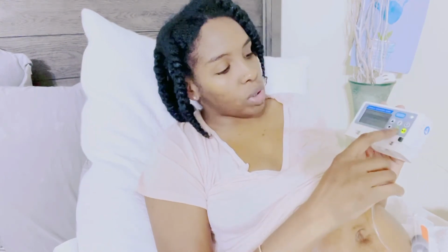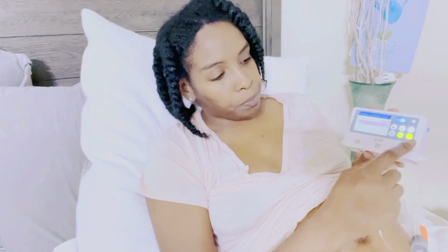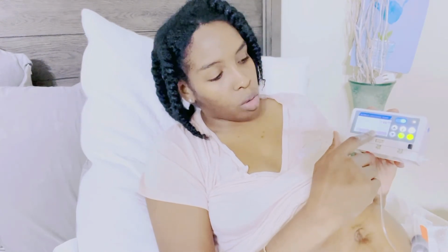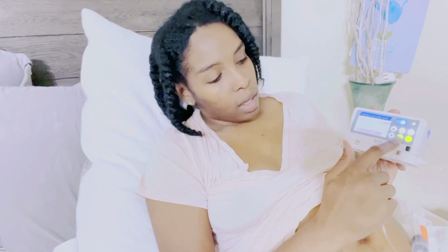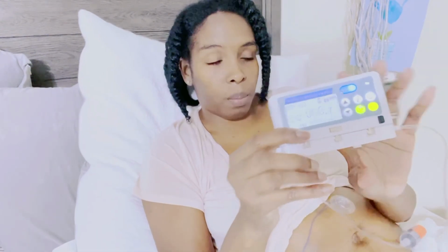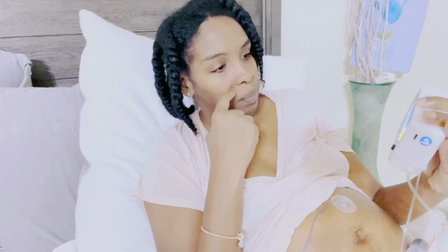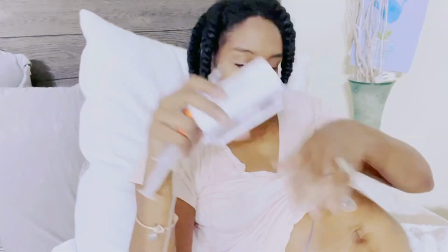So now this says resume infusion. So I'm going to press OK. Then I'm going to press play. And it's just going to go through all the settings. And then once it says press OK to confirm, so I'm going to press OK. So it's ready to start giving me my medication again. And I get 0.7 milliliters an hour. That's my rate. And I'm good to go.